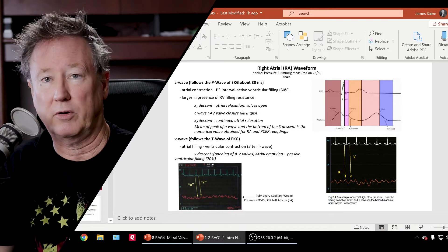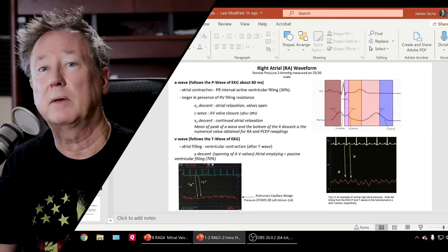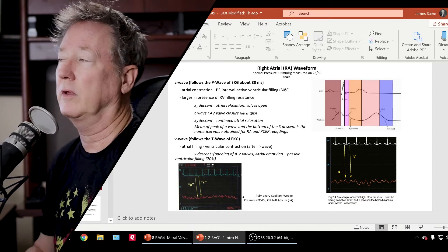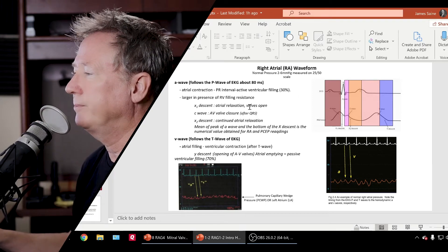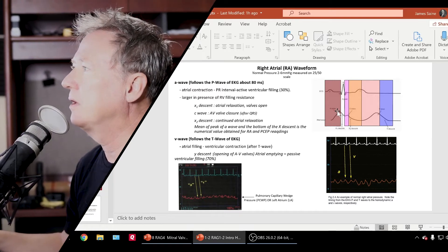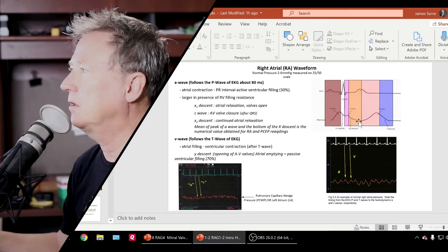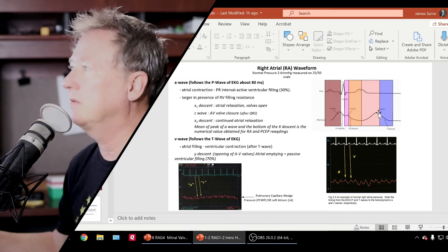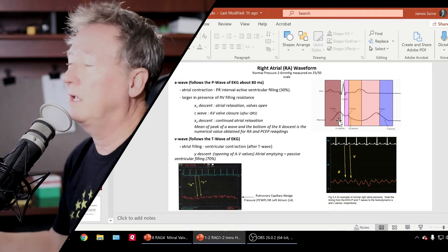You could have a clot in your pulmonary artery or a clot in your left atrium — that would make the wedge estimation of LVEDP inaccurate. So here is a right atrial waveform. The components are an A wave, then a descent, then a C wave, the descent continues, and then another wave called the V wave, and the descent of that. The A wave represents atrial contraction.